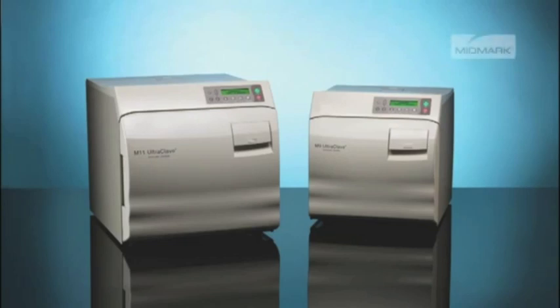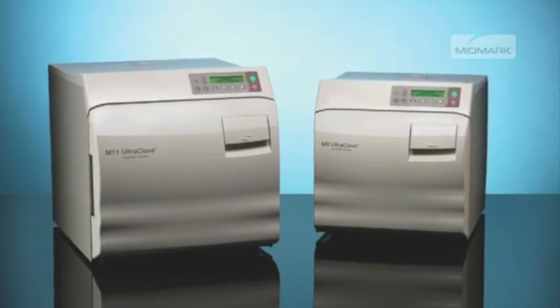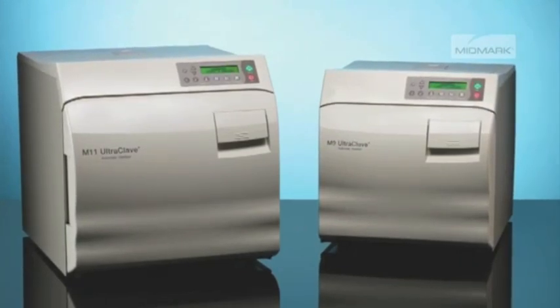For maximum operational flexibility, the M9 and M11 autoclaves offer four pre-programmed cycles with the flexibility to store two custom cycles. Once a custom program has been stored, it can be used just by pushing the one or two control buttons in the same manner as the other standard cycles.